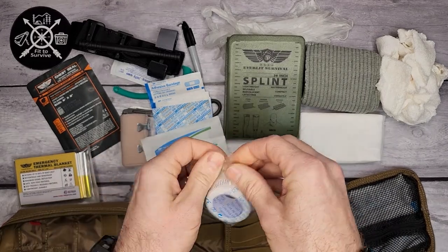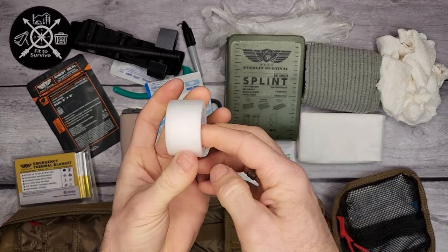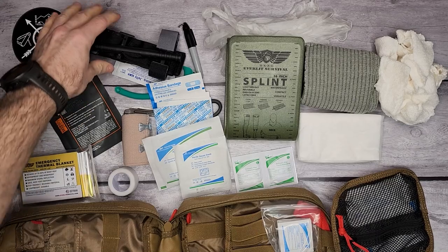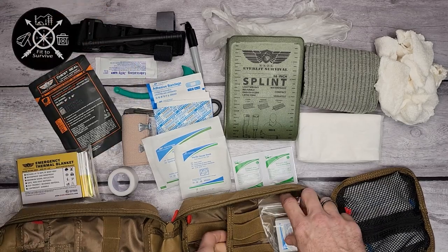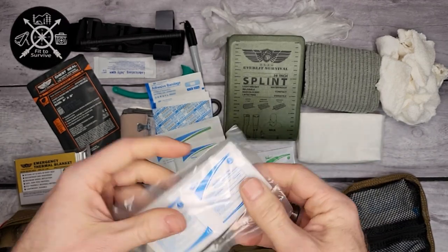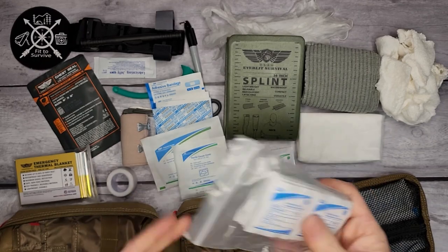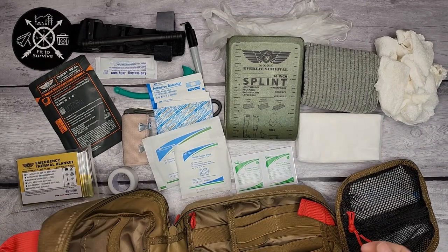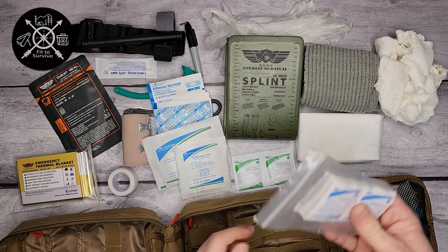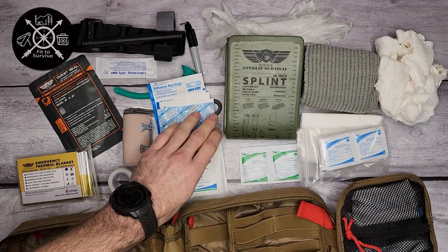There's some standard medical tape — pretty self-explanatory. Then a whole bunch of alcohol prep pads. These are good for getting things sterile and ready, because the last thing you want with any wound is an infection. That's going to help you get things cleaned up so you don't have to worry about infection later on.